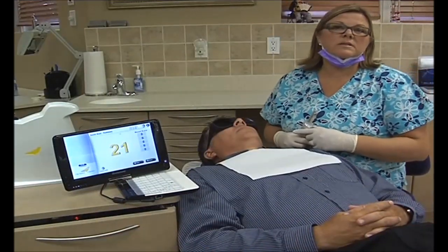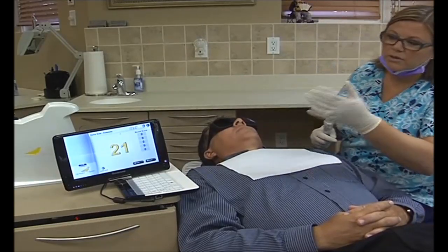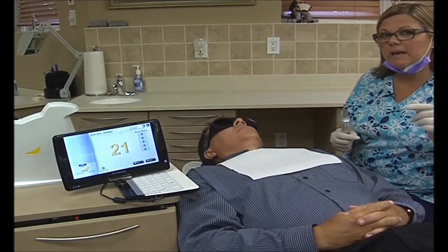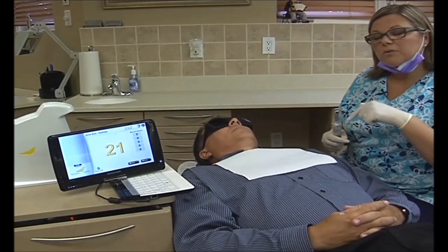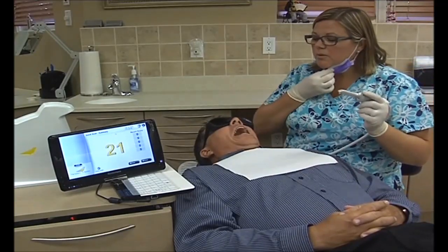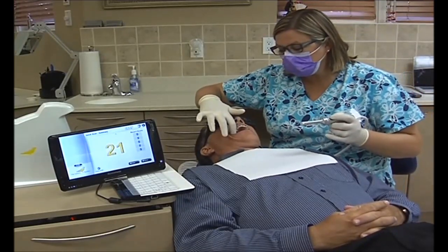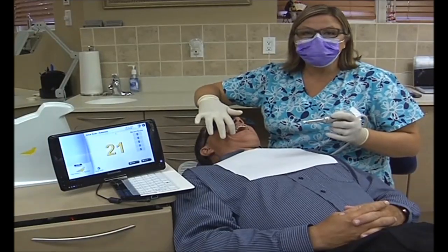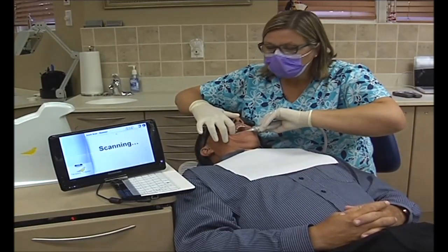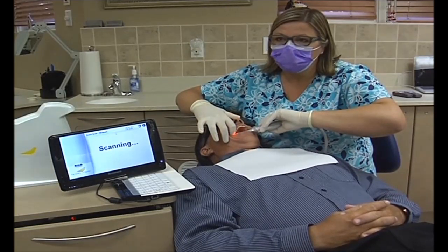Now I'm going to show you the different ways we use the Canary in our practice. The first way is a quick scan — you can see from the monitor it just has one number on there. We don't need to have all the patient information. We're just going to scan a spot, very quick. On our patient Doug, I'm going to go ahead and scan around some old restorations. I'll get you to open up. Where I'm starting is on the 4-6. Doug has an old restoration down here and there's a bit of gray shadowing around the tooth, so I'm going to check around the margins of that tooth. You'll hear a number and it'll also display it on the computer.